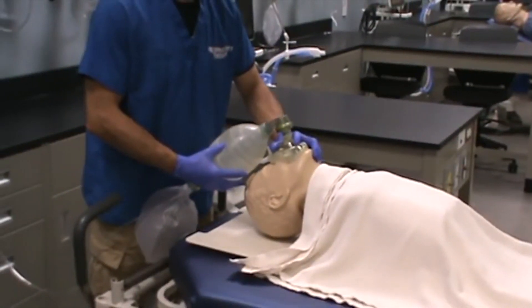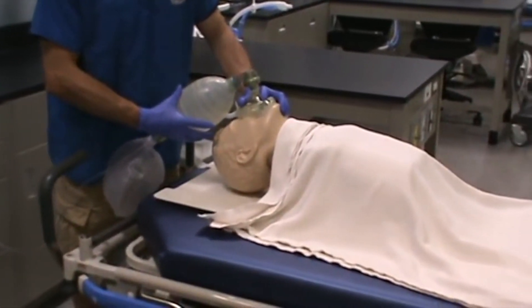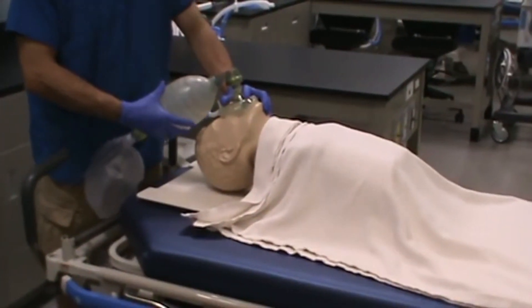Your fingers are spread out in this EC configuration — EC, echo Charlie — and try to ventilate.